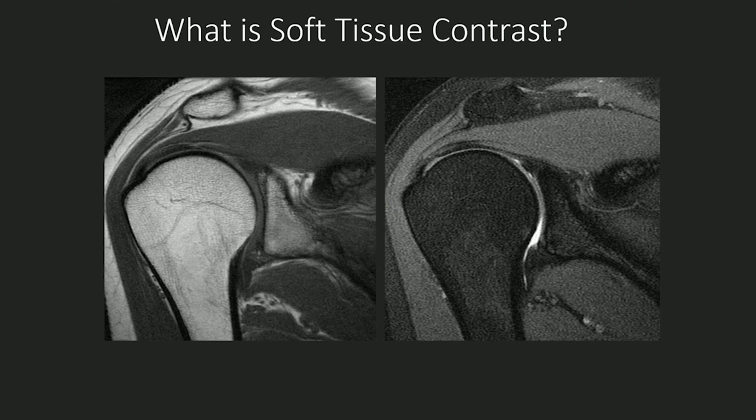In my opinion, we should always have three planes in MRI MSK protocols. There's a saying that one view is sometimes as good as not having any view at all. And the reason that's relevant is that sometimes patients move in MRI, or the images may be degraded in one plane. And if you're reliant on a single plane, sometimes you might not be able to make the diagnosis if you're only comfortable with that one plane.